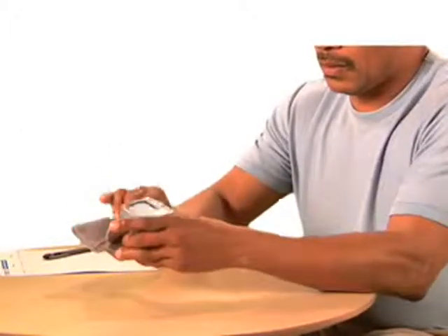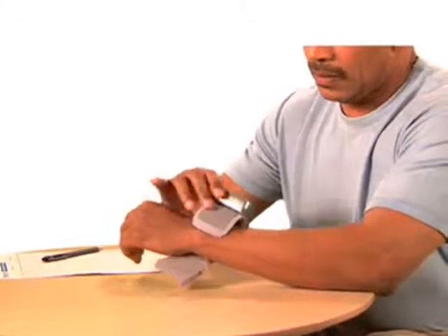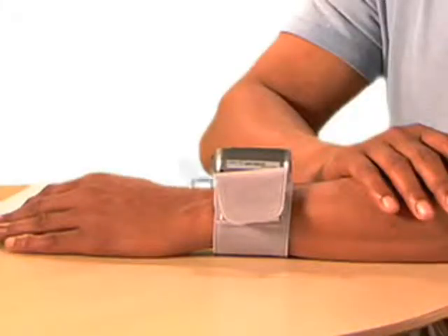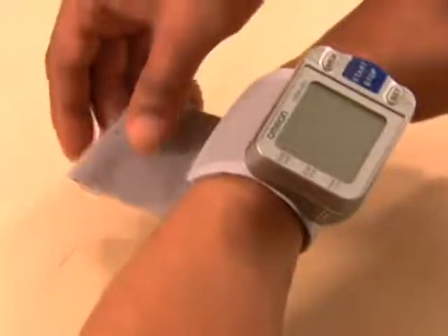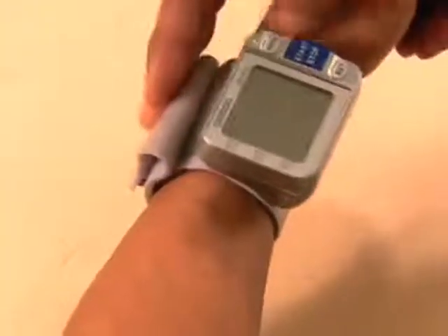Secure the cuff on your left wrist and align the monitor with your thumb. Place the cuff one half inch away from your wrist bone. Hold the bottom part of the cuff and wrap it around your wrist so it fits comfortably and securely.